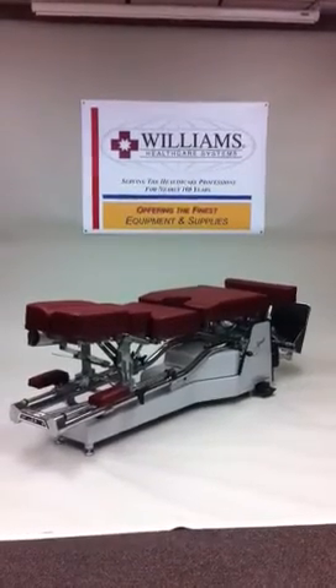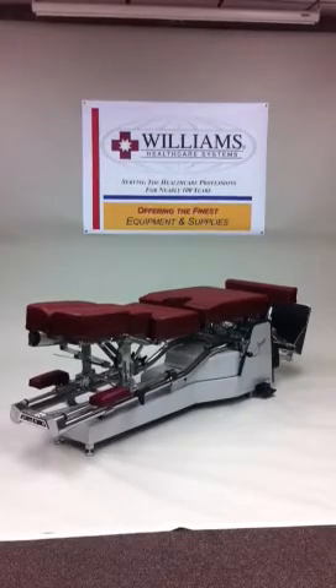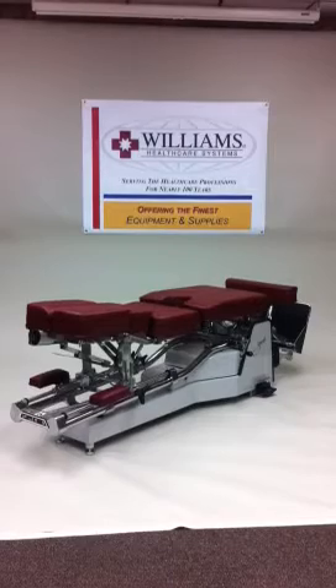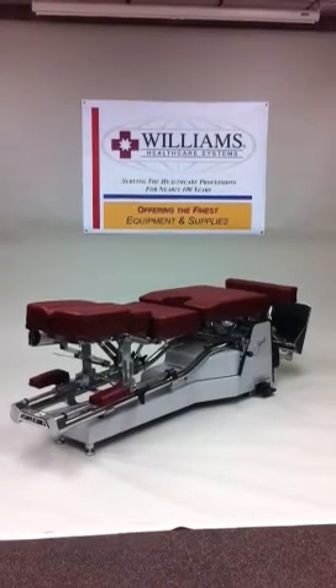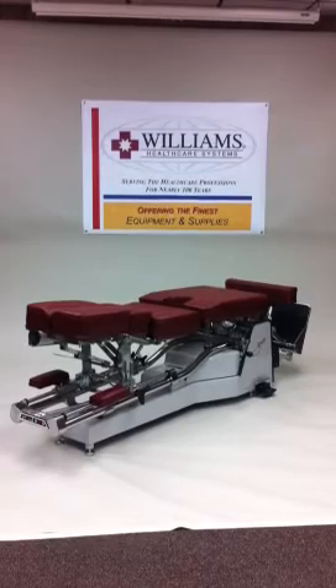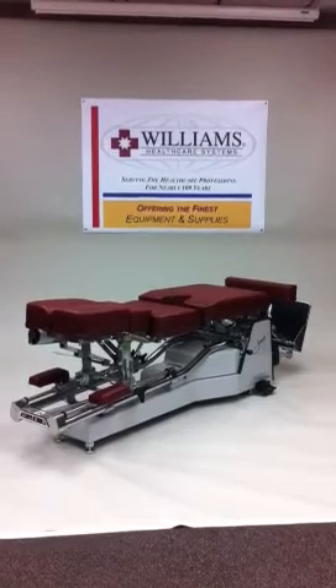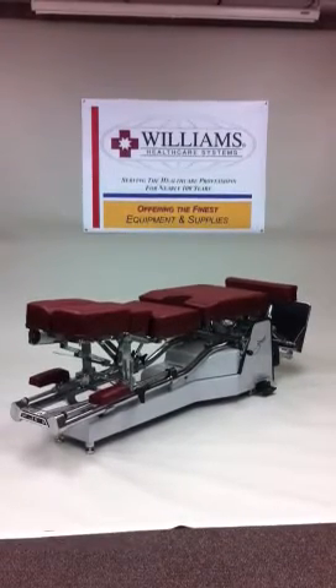The anchor relaxer rest cushion adjusts to relax the patient's muscles. An arc action footboard glides into position, comfortably lifting the patient's feet. This table is demonstrating the tuck away footboard option, and the recessed steel base and frame design provide improved stability and close-in patient treatment.